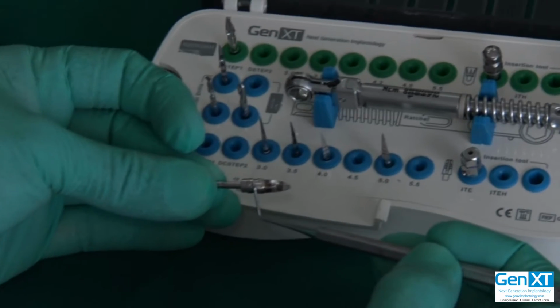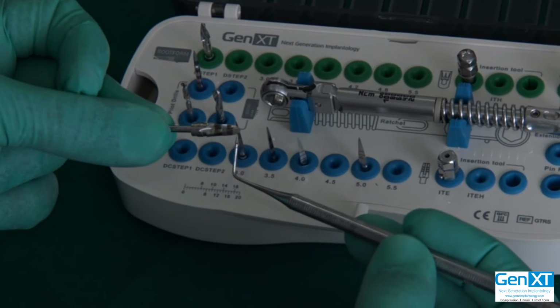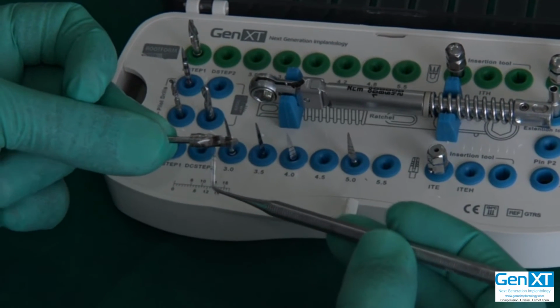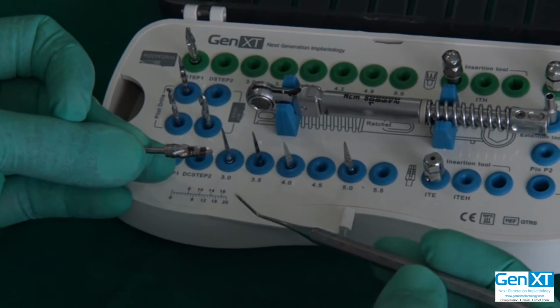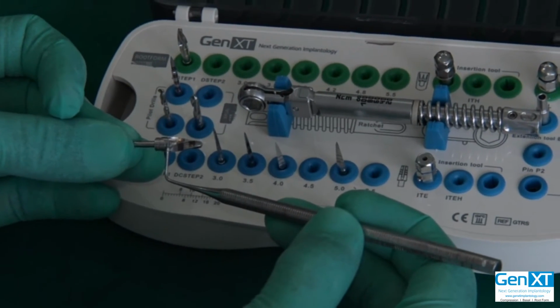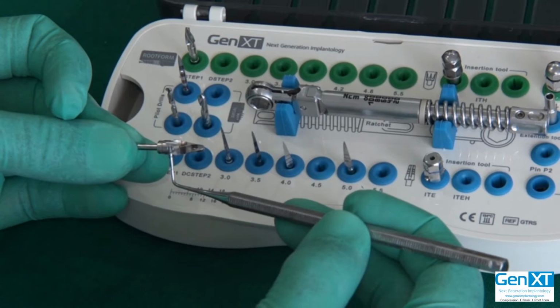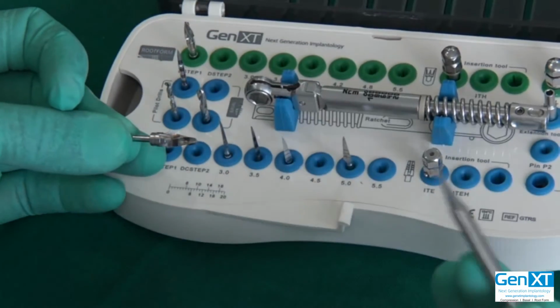So once you have done the depth drill, you just sink the crestal drill up to the desired diameter: 3.5, 3.8, 4.2, 4.8, 5.5. Now, of course, should there be a situation that you want to put a 5.5 by 6 millimeter implant, this drill cannot be used because here the 5.5 comes at a distance of 10 millimeters. There is a special crestal drill available for the 5.5 by 6, which is only for that particular implant.